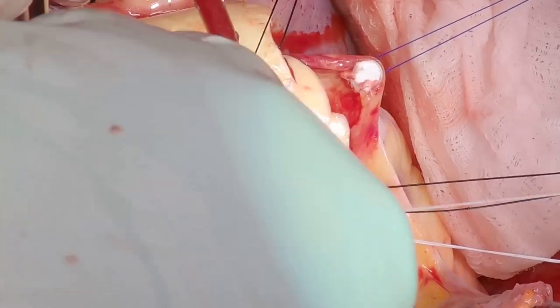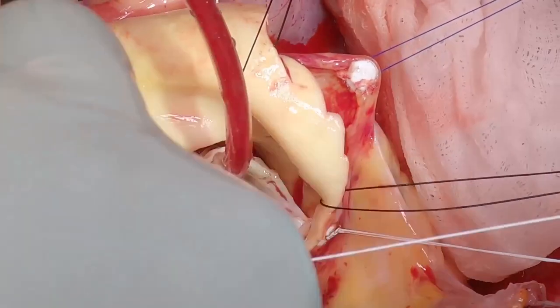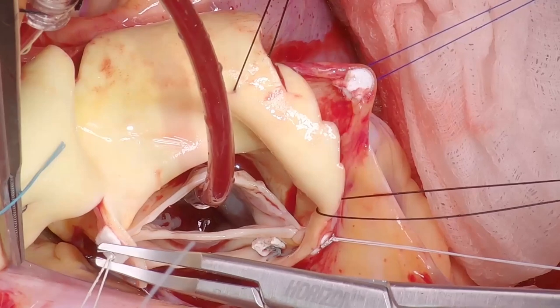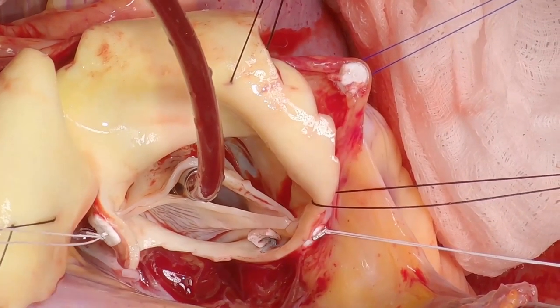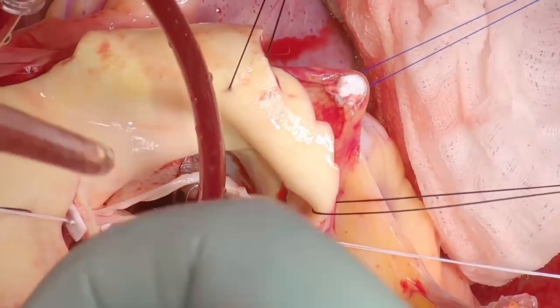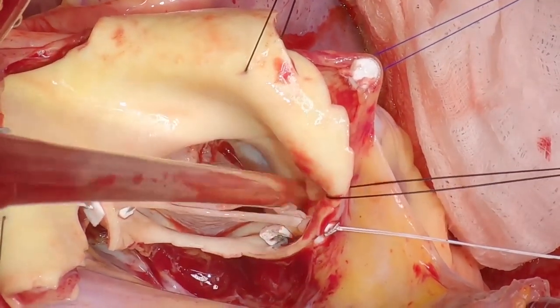In this case, we're going to need to do that — there's too much prolapse on the conjoint leaflet between the left and right cusps. Again, just a clip on that to stop it from becoming unraveled. Now we'll have a good look and see how symmetrical the leaflets are.